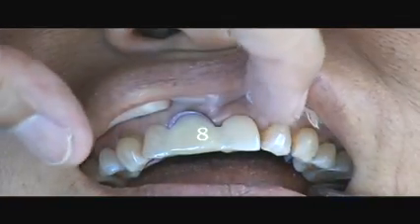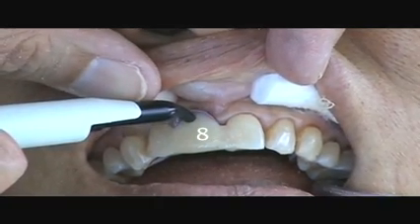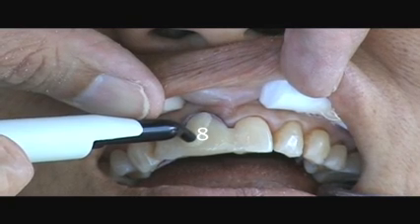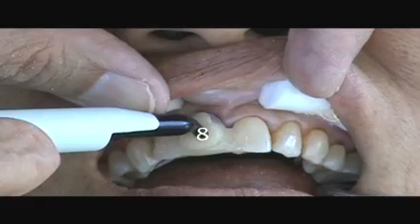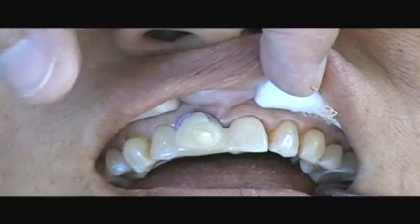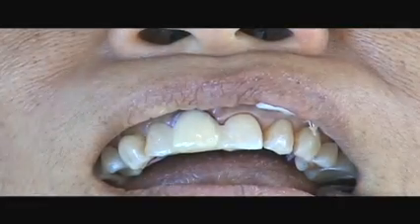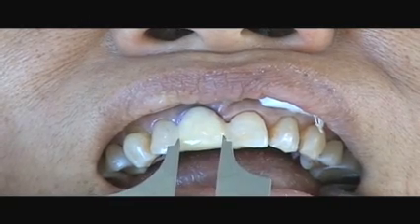Any deficiencies, for example here at the cervical of number 8, can be corrected at this time with additional application of finishing composite, adjusting for the height, width, and thickness as desired for aesthetic result. Doing this now lessens the need for shaping with rotary diamonds later. As one progresses in proficiency, one need not do measuring as seen here.